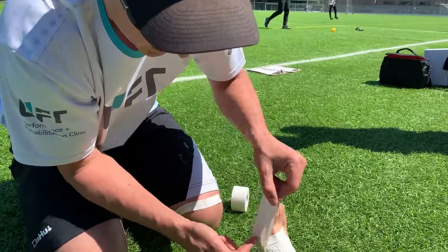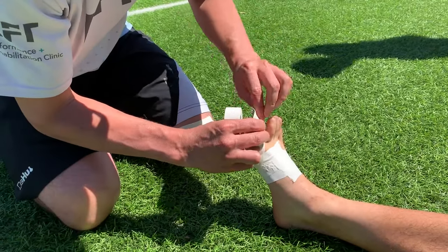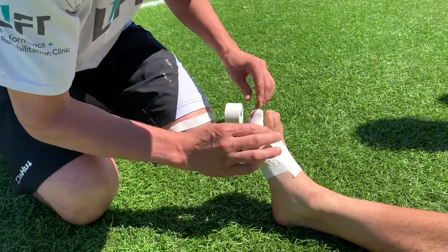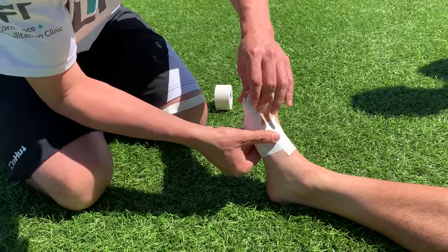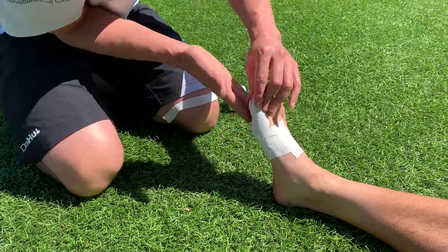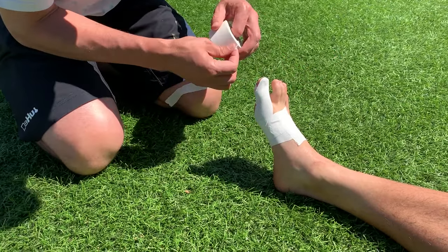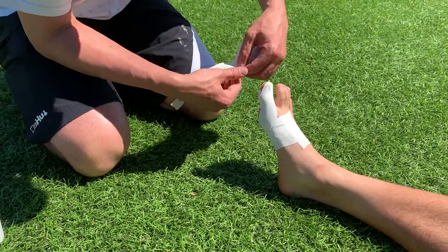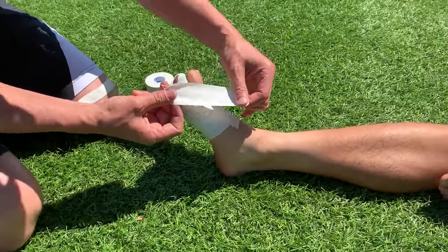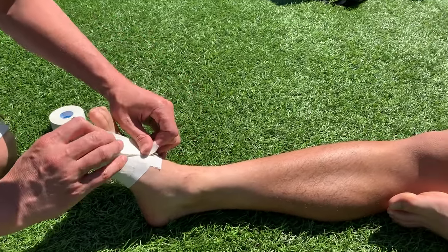They're all going to target this joint that we're interested in, so you can see where the joint is. We're going to cross that joint and basically just need to be able to wrap onto our anchor a little bit. So this angle here — what's that going to restrict? It's going to restrict this motion. If I go onto the bottom of the foot it's going to restrict this motion, but we don't need that in this case. We need strips going over the top, so this one is over the top a little bit, and this one is over the top a little bit as well.